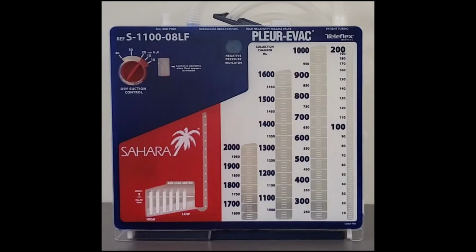On the front face, we have the dry suction control knob, negative pressure indicator window, the air leak meter, and the collection chamber denoted in mLs. Here at the top, we have the suction port where the tubing is connected to the suction, the needleless injector site, high negativity release valve, and the patient tubing connection. At the bottom, there is a base stand that also swivels to make it extra secure.